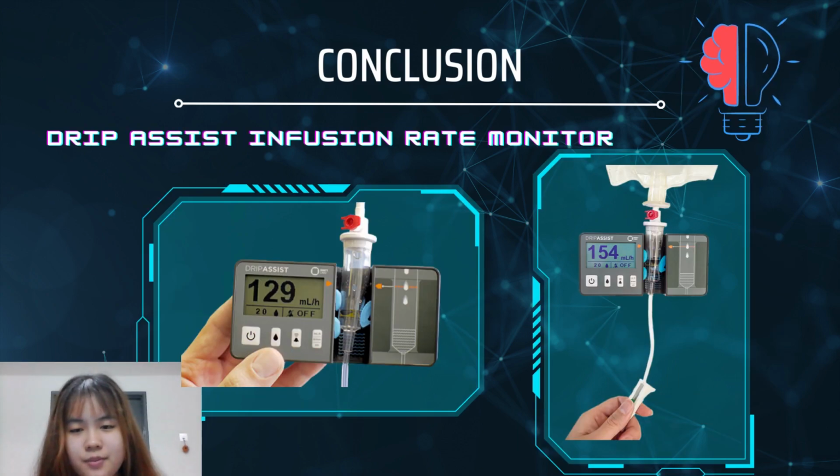This is the Drip Assist Infusion Rate Monitor, which also operates as a device that we made, but it can only display the drip flow without controlling the dripping.